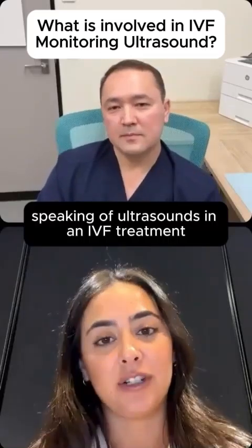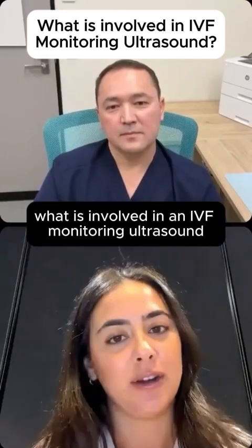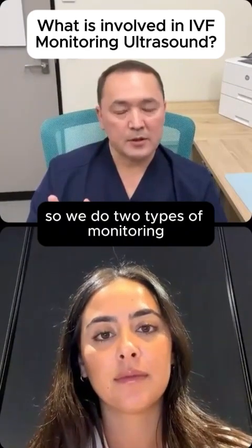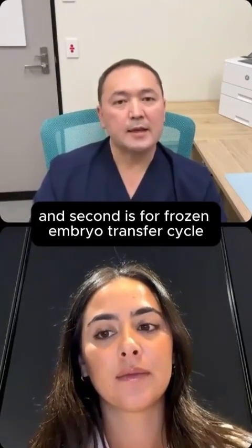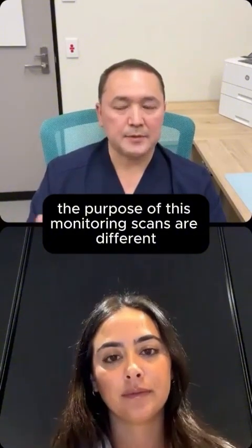Speaking of ultrasounds in an IVF treatment, what is involved in an IVF monitoring ultrasound? So we do two types of monitoring ultrasound scan in IVF: one for a fresh cycle, when you are doing ovarian stimulation, and the second for a frozen embryo transfer cycle. The purpose of these monitoring scans is different.